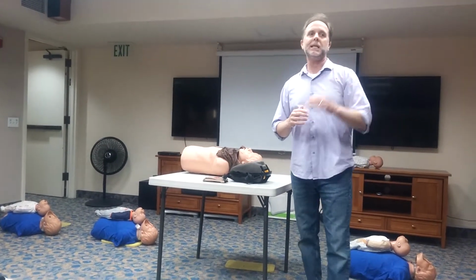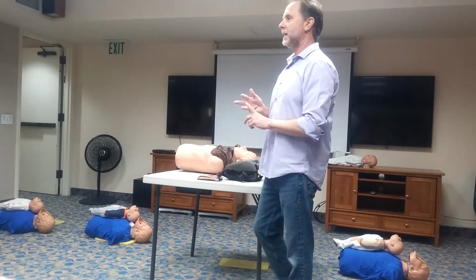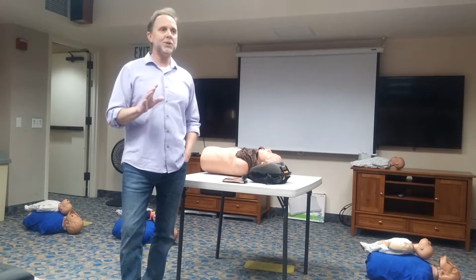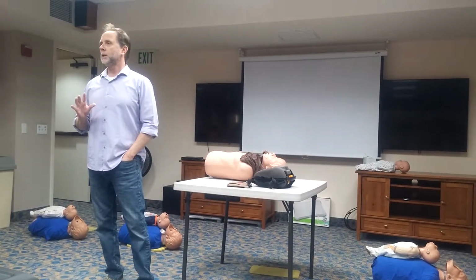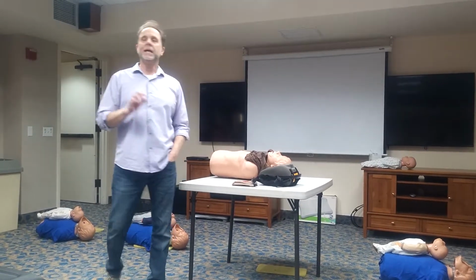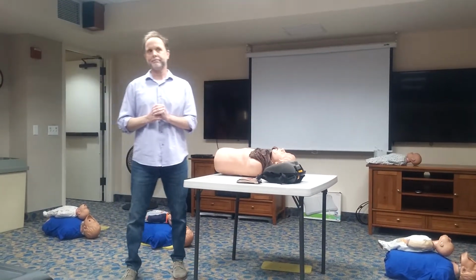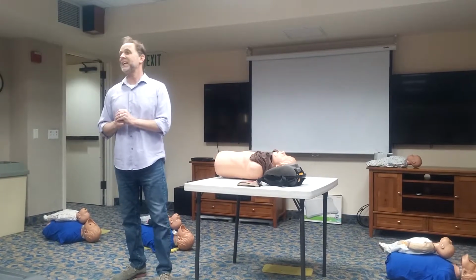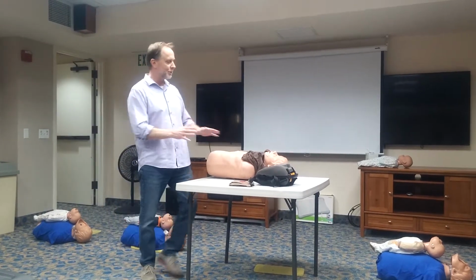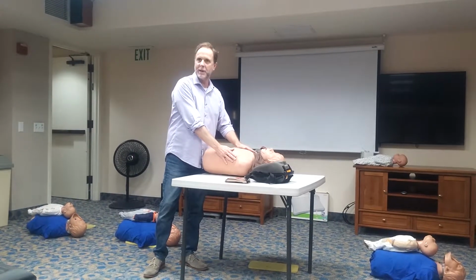We can use the AED on adults, children, and infants. If it's an adult victim, this is important: adults for AED usage are considered 8 years old and older. Children are 1 to 8, infants newborn to 1. If we use this on an adult victim, we use adult electrodes only. If it's a child victim, our first choice is pediatric electrodes. However, if pediatric electrodes are not available, we can use adult electrodes as long as the pads are not touching. There has to be a gap between the pads.